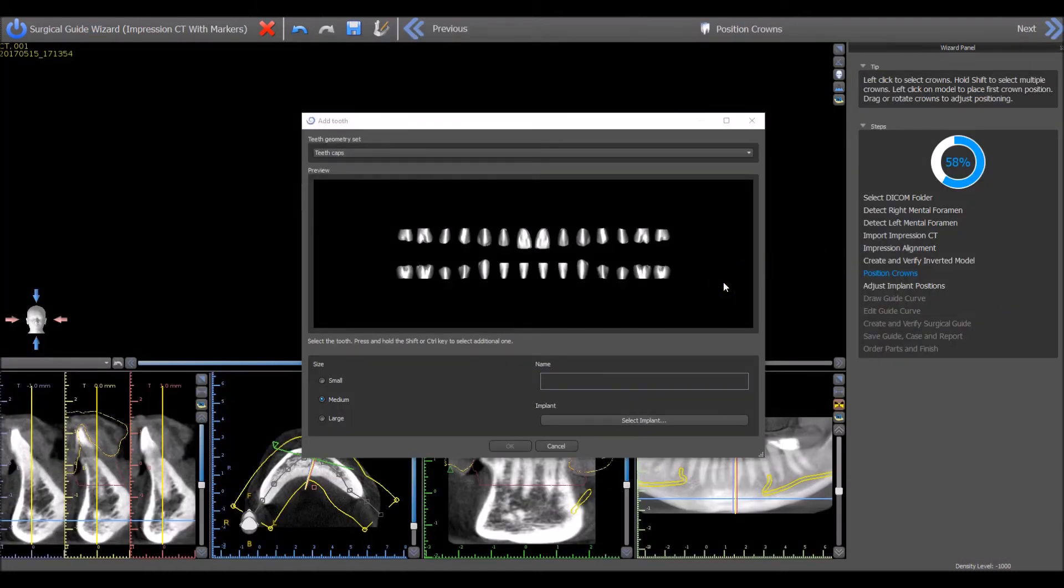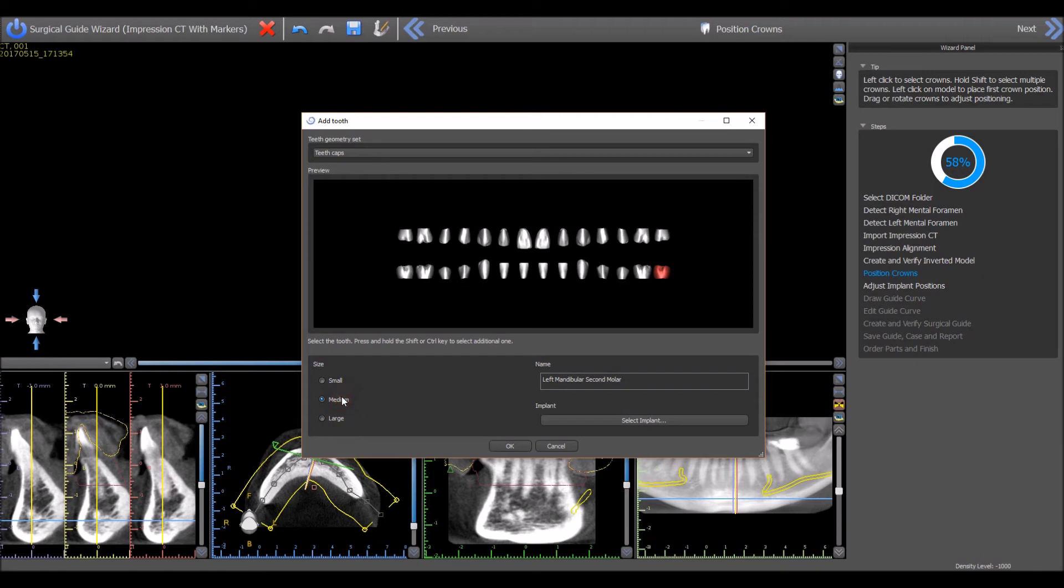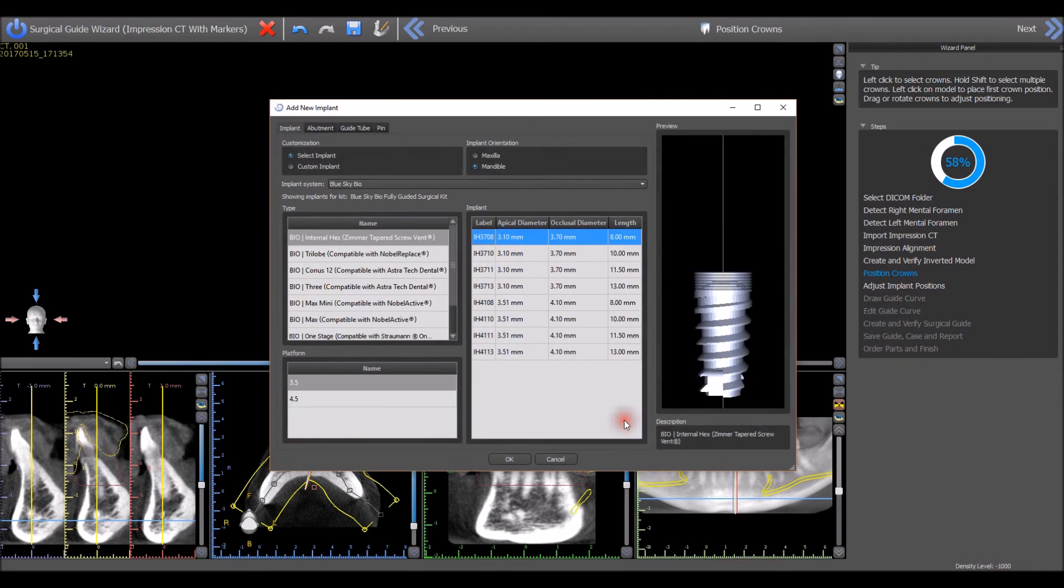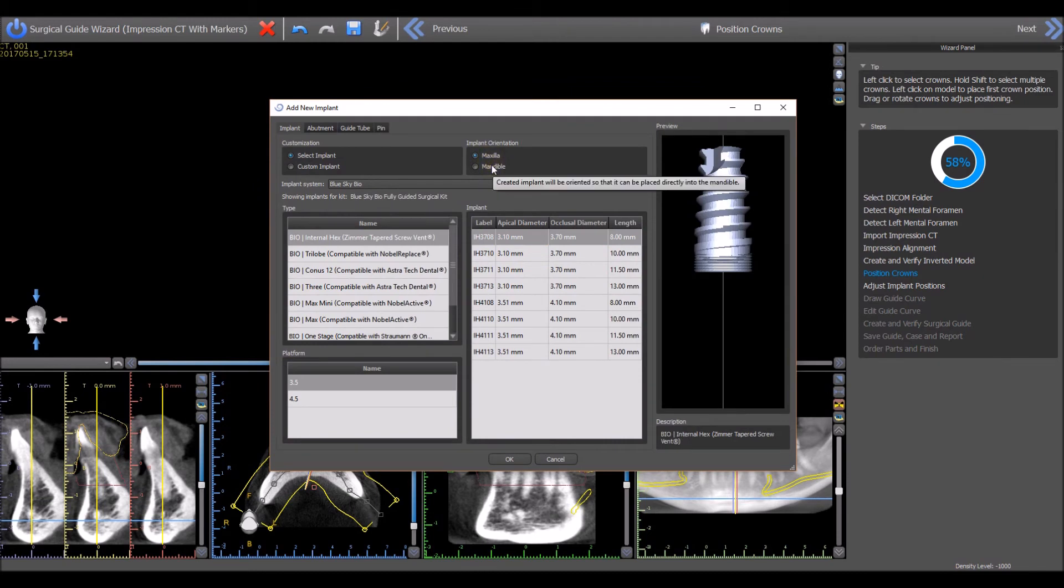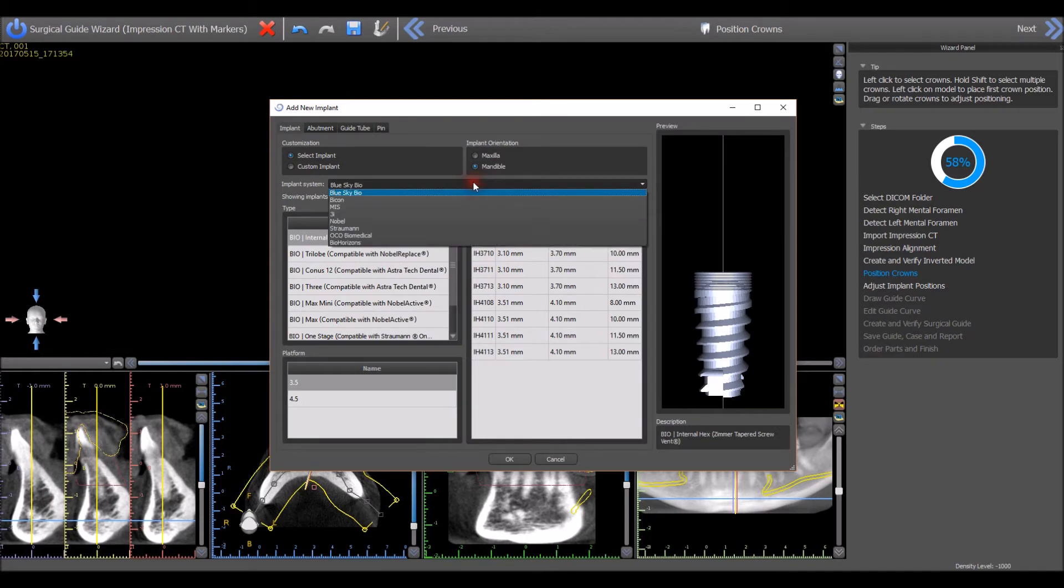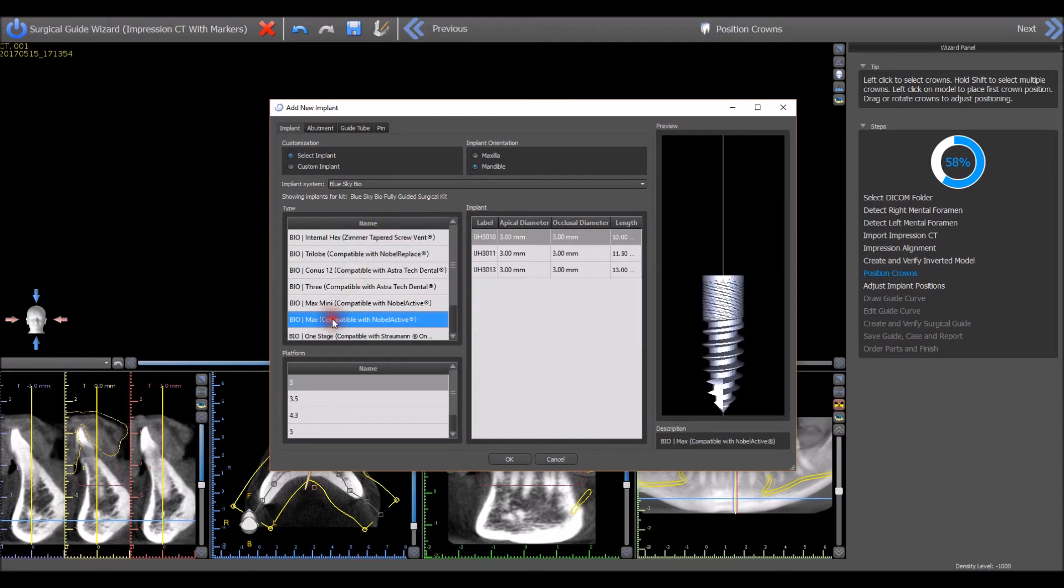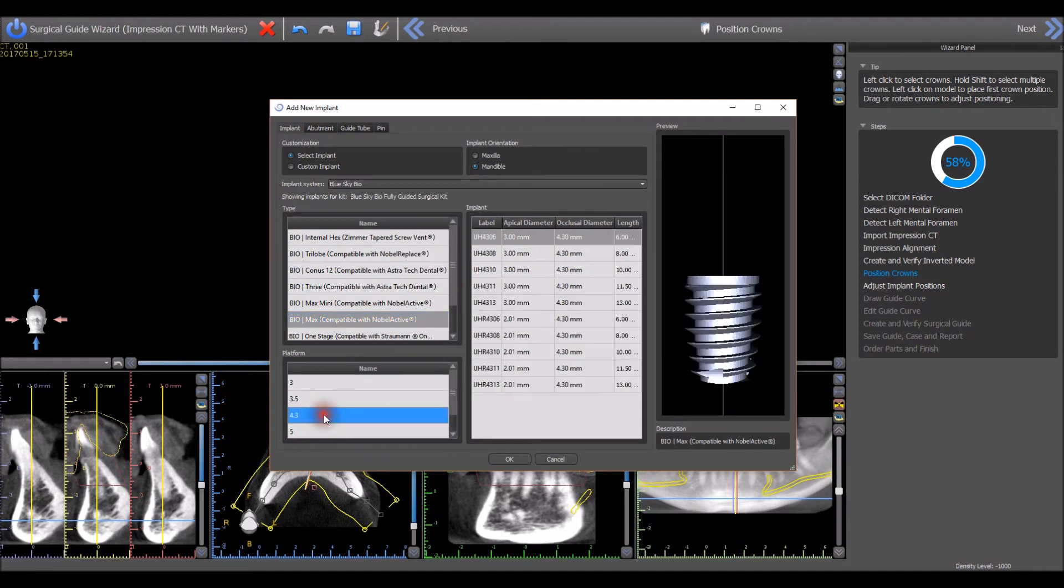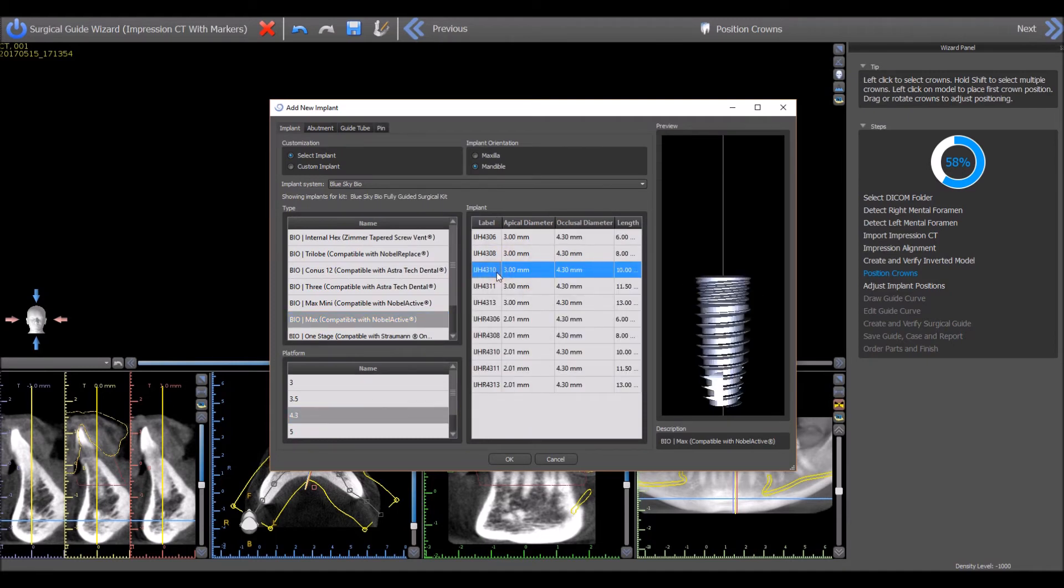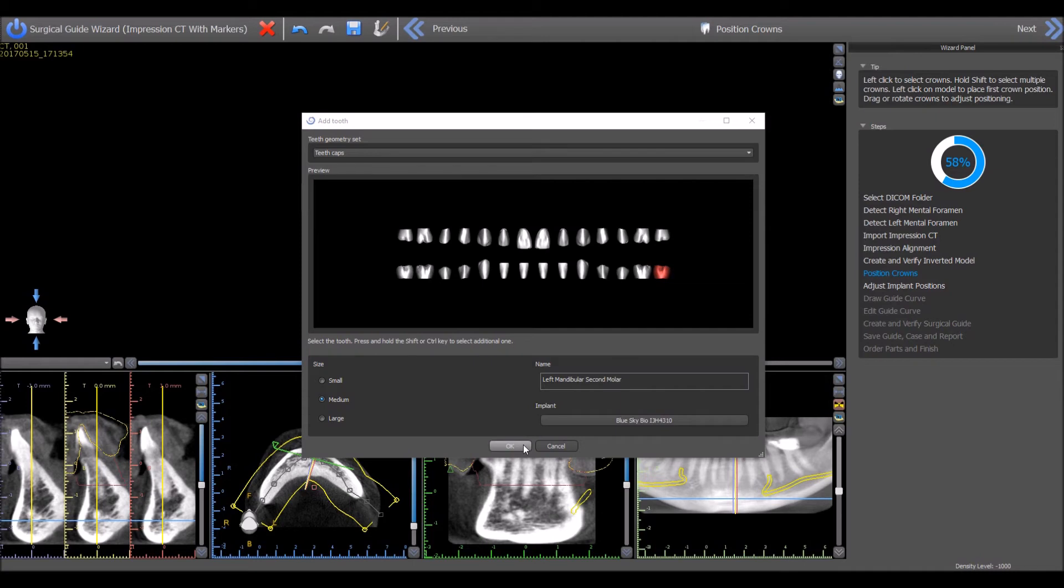Left-click to select the correct virtual tooth in the location of the missing tooth. Select Small, Medium, or Large to represent the size of the desired virtual tooth. Press Select Implant to select the desired implant to be placed together with the virtual tooth. Select Mandible as the implant orientation. Select Blue Sky Bio from the Implant System drop-down. Select the BioMax Implant Type, 4.3 Implant Platform, and the 10mm Long Implant. Press the OK button. Press the OK button to confirm the virtual tooth and implant selection.